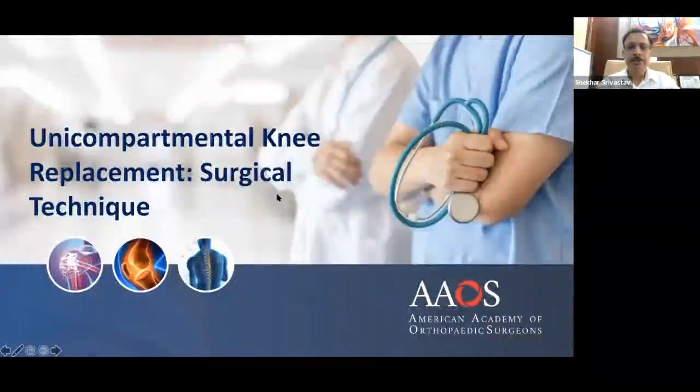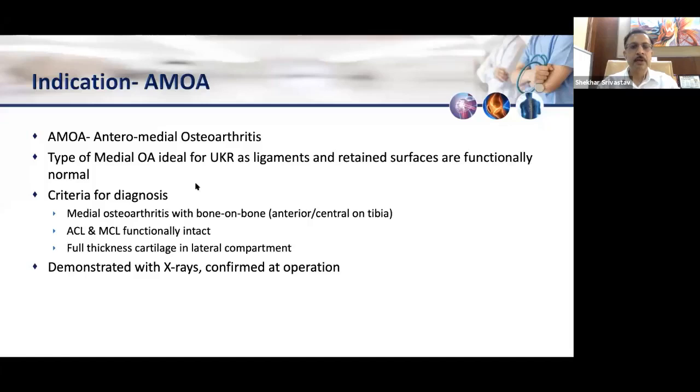So this presentation is basically focusing on the surgical technique of performing unicompartment knee replacement. The indication of unicompartment knee arthroplasty is basically anteromedial osteoarthritis. We know that the knee has three compartments: the medial compartment, the lateral compartment, and the patellofemoral compartment. In early cases, frequently we see that the medial compartment is more commonly involved.